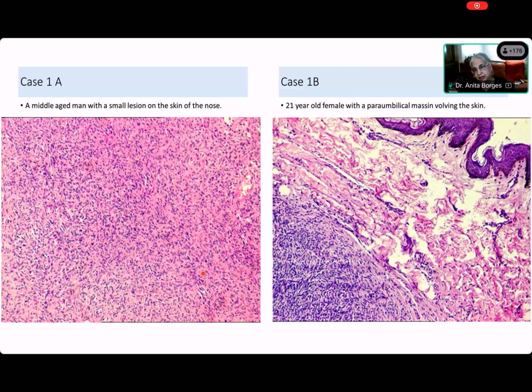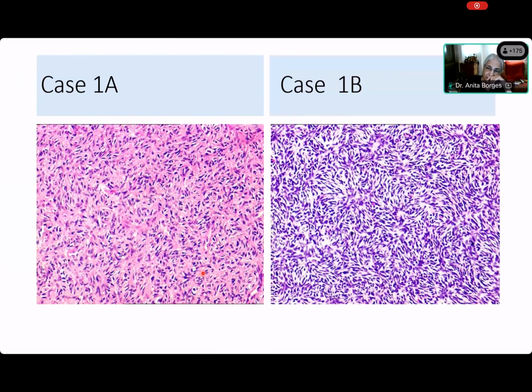So now all of these we have named. Saida, which one is this? Haphazard pattern. Haphazard, you really think it's haphazard? All right, Saida, I gave you these pictures, right? Now you're telling me this is haphazard? You have seen the pictures. Storiform. So then why did you say it was haphazard? It is storiform. Left is storiform, right is storiform.